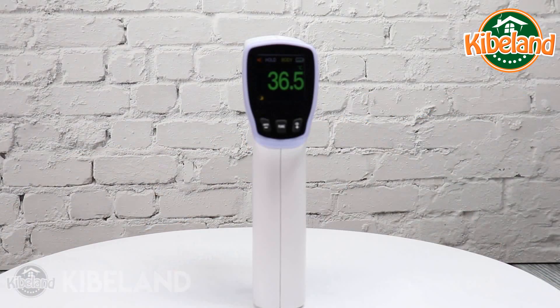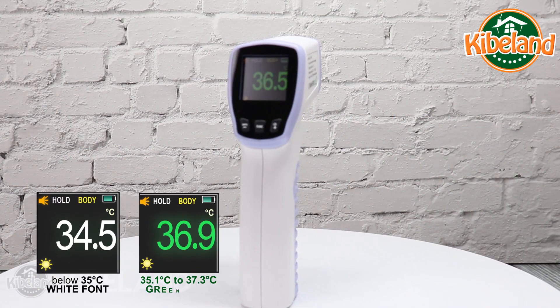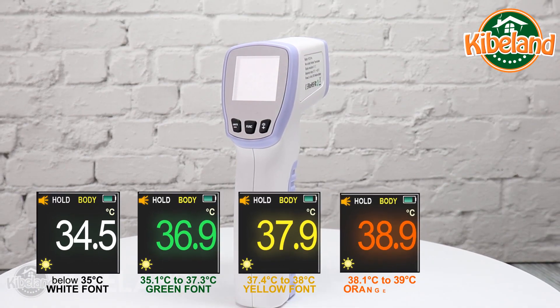Pull the trigger to return to the measuring mode.